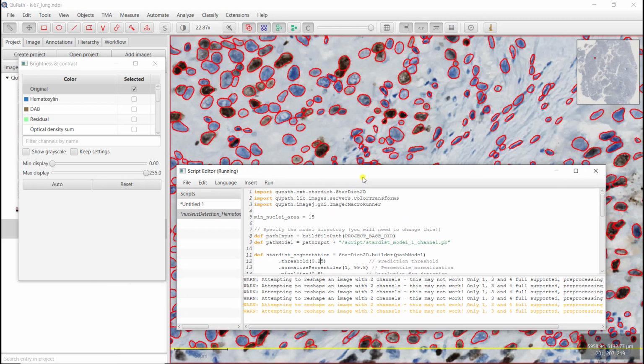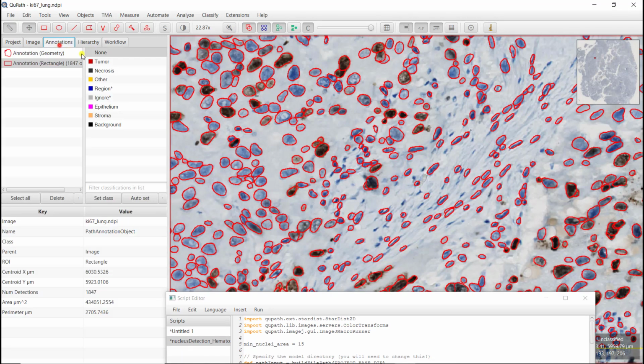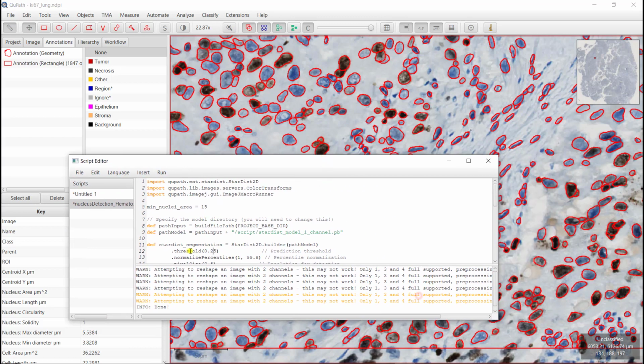And so if I want to get them, I might have to decrease the threshold of the area. So now it's down, I still don't have them. One thing that might be useful is to select small ones. This one looks really small, and what's the area? The area is 16. So if I put a threshold at 15, that's almost the smallest area I can segment. At the same time, now I have this kind of things, which is really nothing. So I need to increase my threshold for sure.